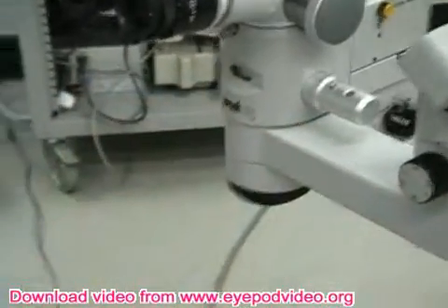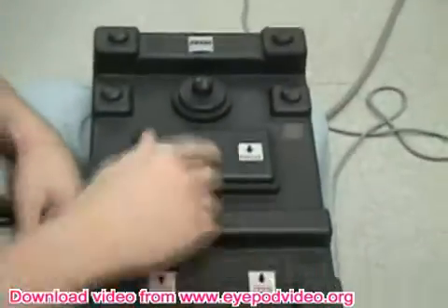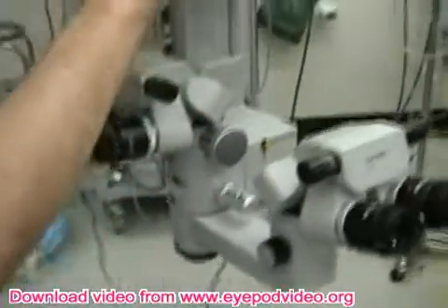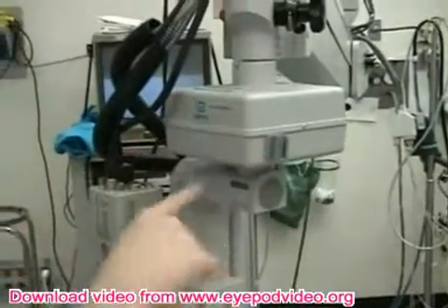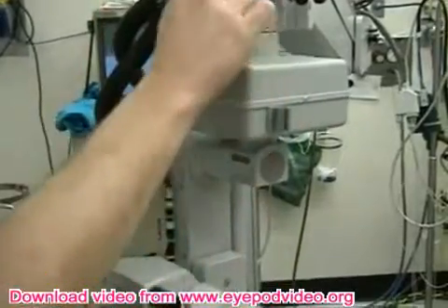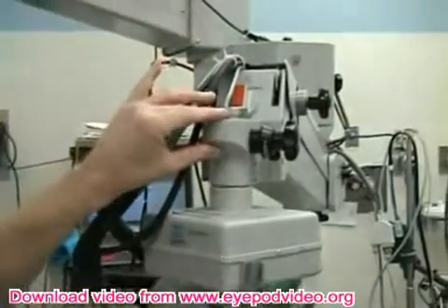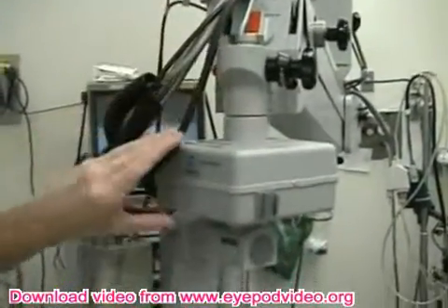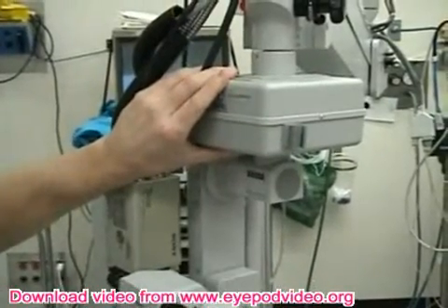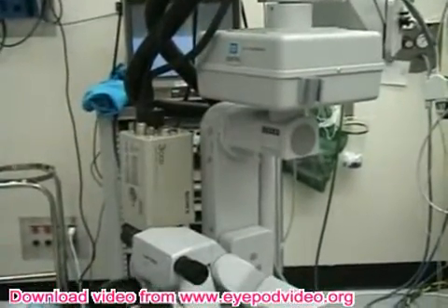In addition to the ability to zoom and the ability to focus with these pedals, there's also an XY. At the start of the case you push the XY — you saw it just centers it. That centers the microscope in this box relative to the stand. If you want to make subtle variations in where the microscope is, you use this little joystick with your toes and move it around.